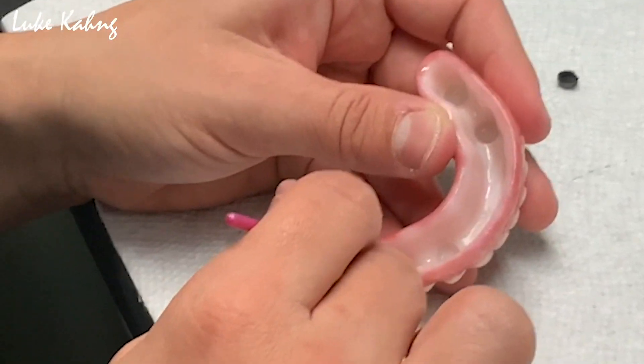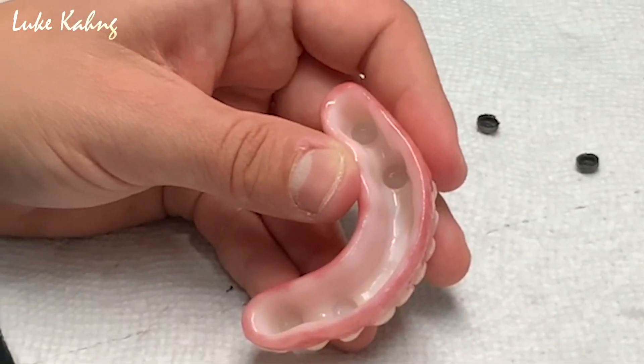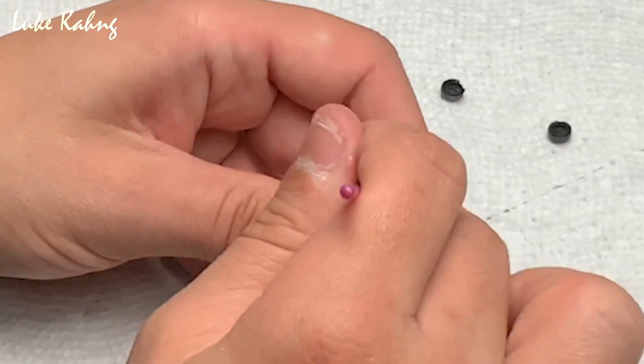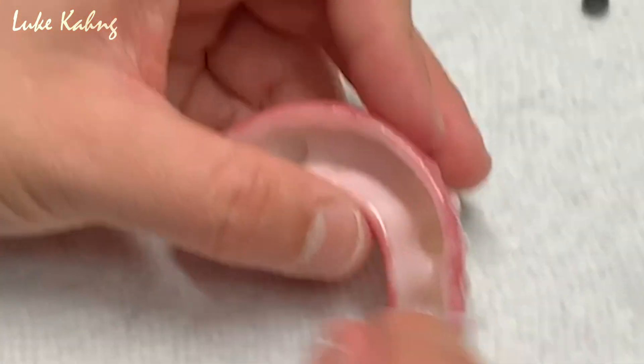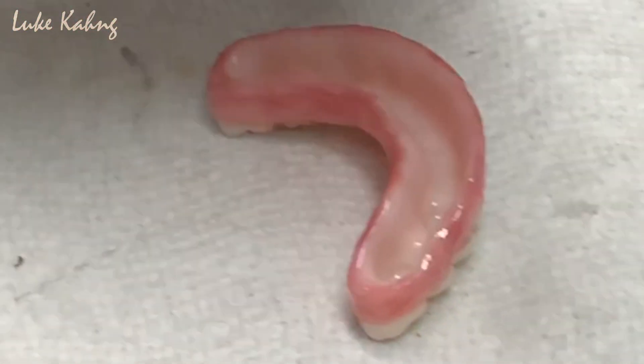First, only apply the Metal Primer Z to the attachments, then apply the G Multi Primer to both the attachments and the zirconia locator.